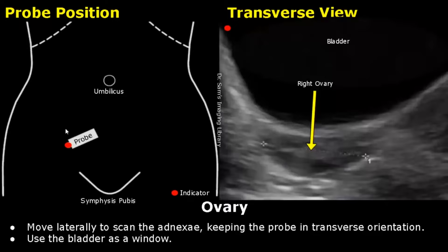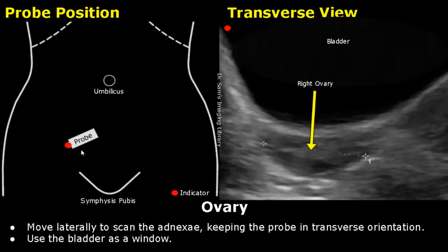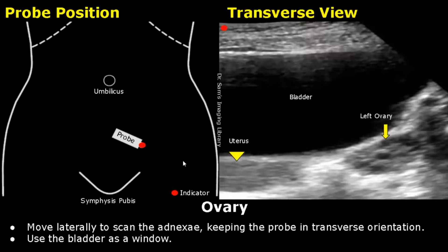Move laterally to scan the right ovary. By using the bladder as a window, you will find the right ovary at this location. You can rotate the probe in an oblique orientation if there is some difficulty in locating the ovary. Now move to the left side to scan the left ovary in transverse view. This is the left ovary near the uterus in transverse plane.